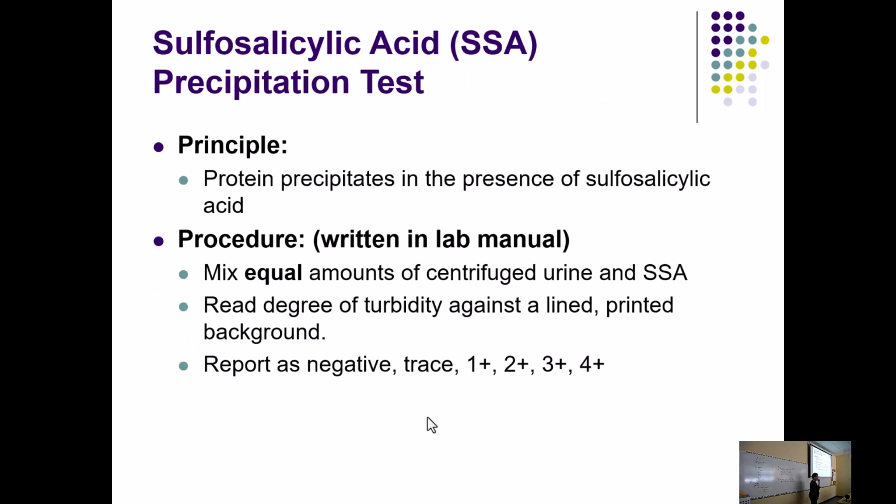So the sulfosalicylic acid test, the SSA, you only have to call it the SSA. I'm not going to make anybody spell the sulfosalicylic. I just think it's fun to say. You know, some things I stumble over, I just love that word. I don't know.